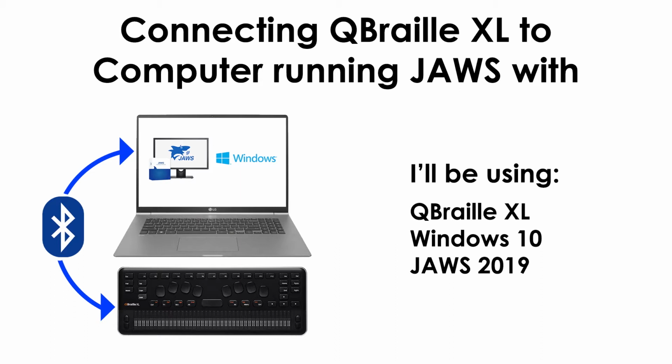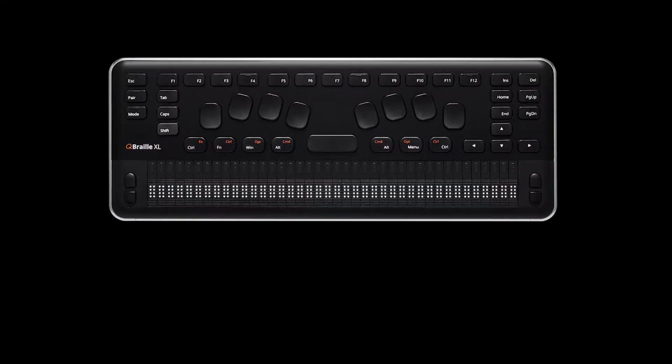I'll also be using JAWS throughout this video, and we'll discuss how to perform each step using both a mouse and with JAWS. Let's start with my computer and QBraille turned on, but I won't have them connected just yet. When connecting the QBraille XL and JAWS with Bluetooth, we won't need to download or install any drivers since it's already in JAWS. So the first thing I'll do is connect my QBraille to my computer with Bluetooth.